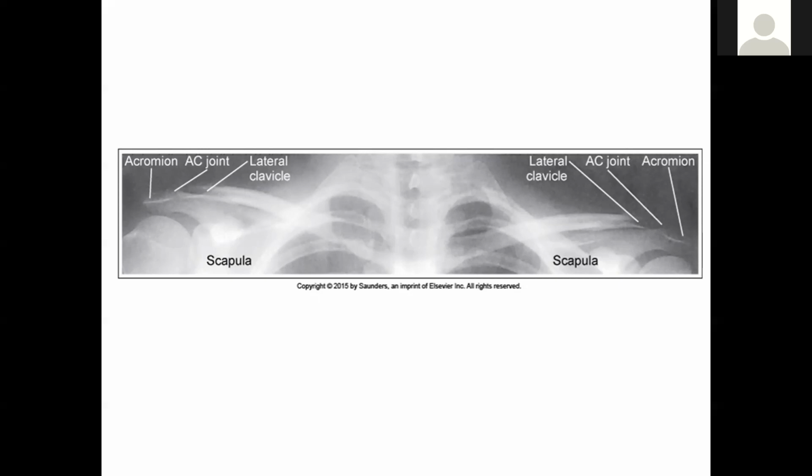So your patient is centered against the bucky. I recommend the more distance, the better for AC joints, particularly with broad-shouldered people. At 40 inches, you will have a hard time fitting the joints on the image, and even some very broad-shouldered people will not fit at 72 inches, but you can back up the tube and adjust your technique, and you may have to turn the key on the collimator, but the extra SID will allow you to fit more anatomy on the image.